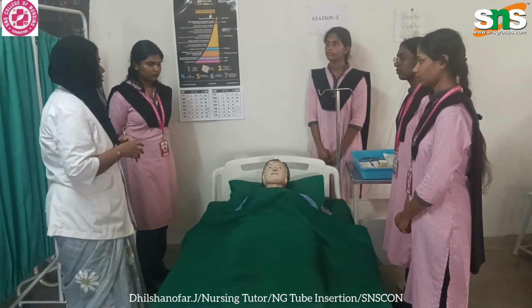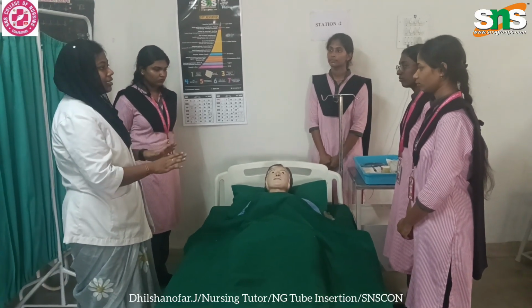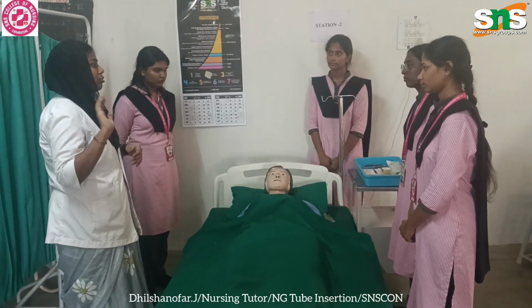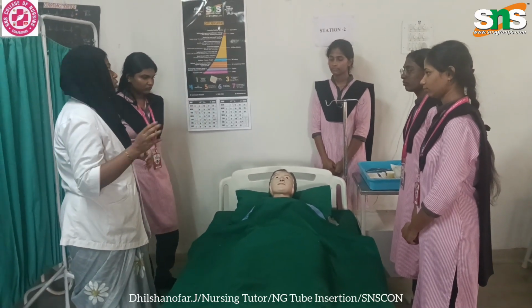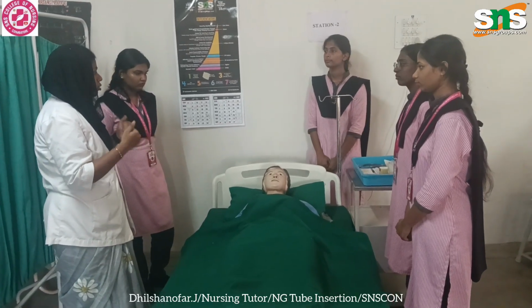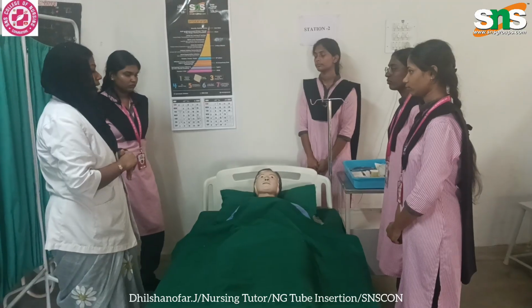After getting the consent form, first thing is you have to arrange the articles near the bedside of the patient. Then we have to provide privacy. No attendants should be inside, only the doctors and those who are going to perform the procedure should be inside the area.